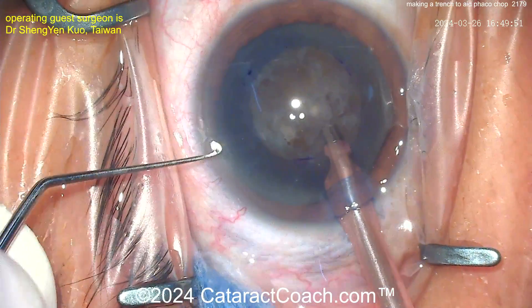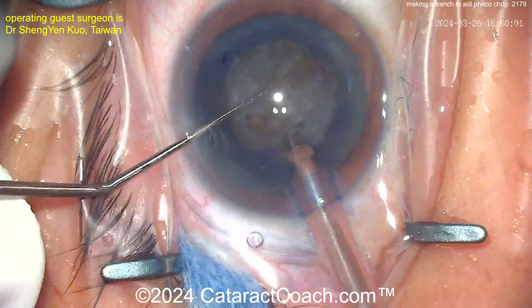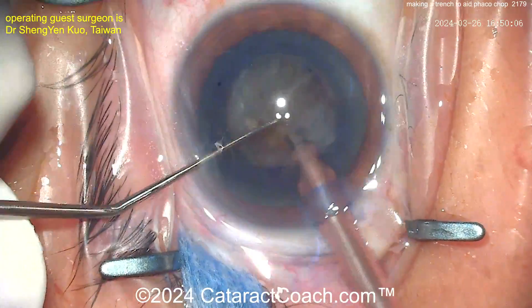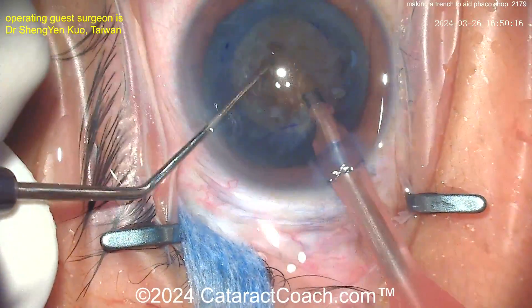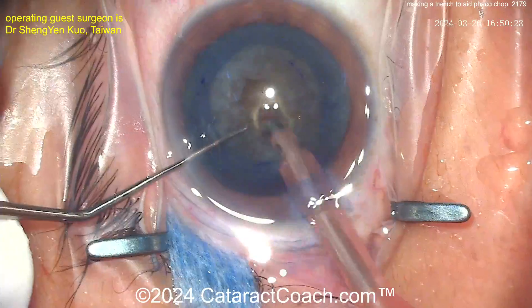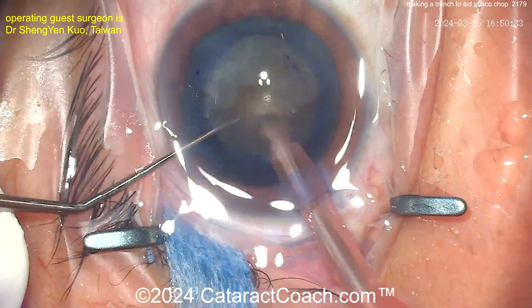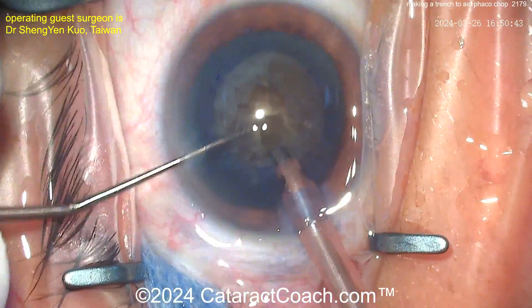The side port mirrors the entry point, and here comes the chopper — rotating the nucleus around a little bit. This trench is right inside the subincisional rhexis, running from the subincisional rhexis to about the center of the nucleus. You can see a little bit of a groove, or a pit, or a trench — whatever you want to call it.